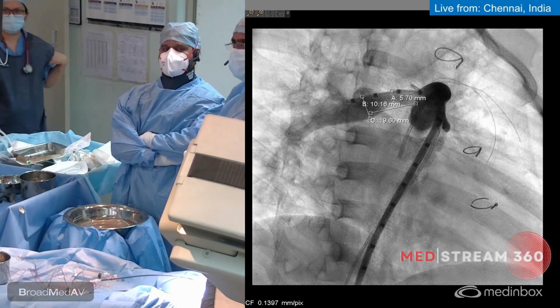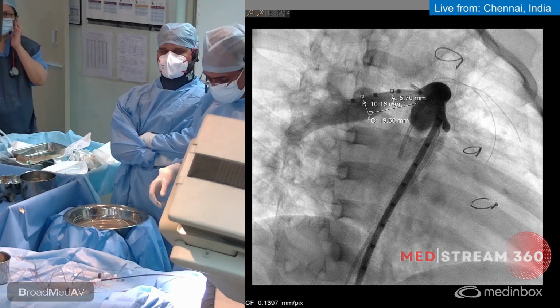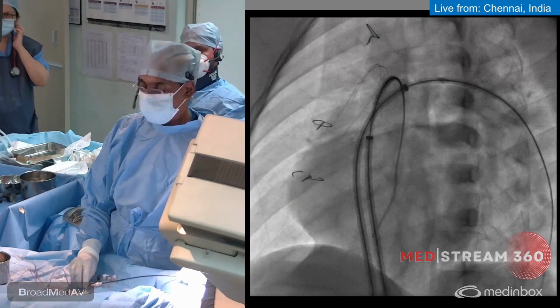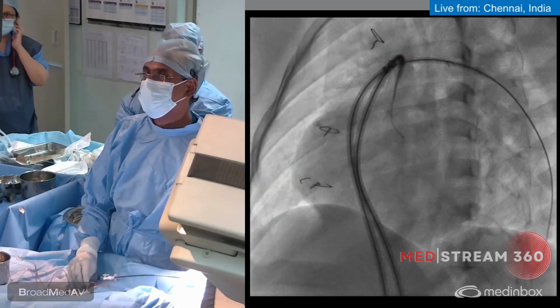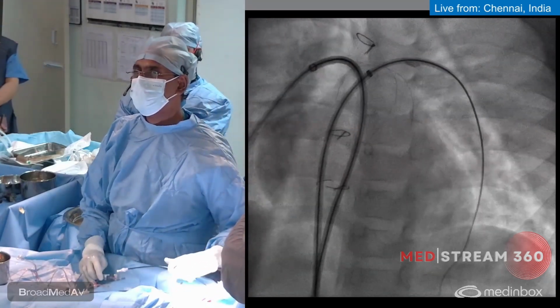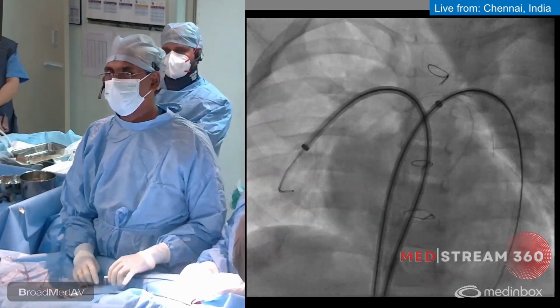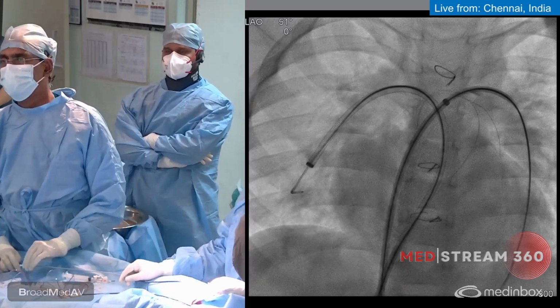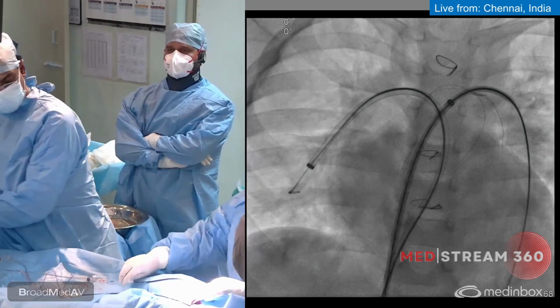I think we'll go for the second option, a pre-mounted stent, and then go for a longer option. Let me first get the stents deeper into the pulmonary artery. So now I'm having the right pulmonary artery stent sheath. Planning to advance the sheath. Advance the sheath. So we've gone across the right pulmonary artery, holding the sheath. And similarly, I'll advance into the left pulmonary artery.